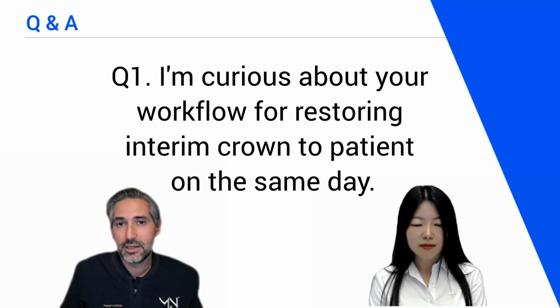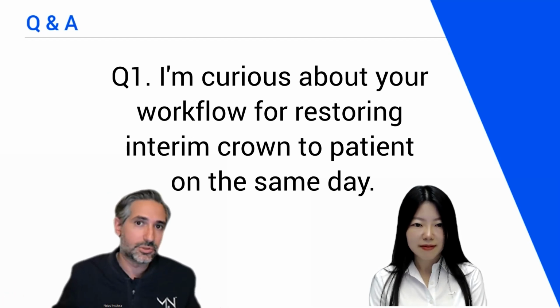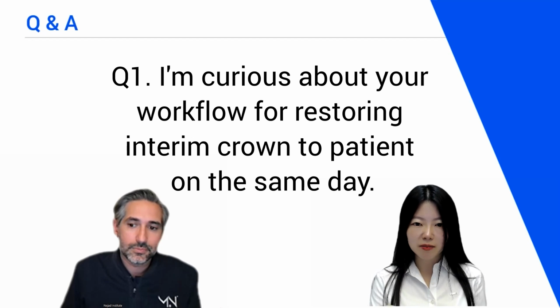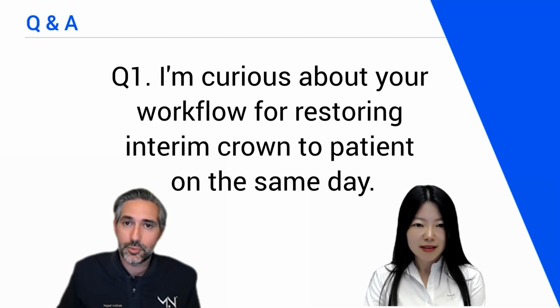You can also try doing the 3D printed shells before the appointment and reline them. That's also not a bad approach, but all in all, I don't find that necessary for 1 or 2 teeth, and I would reserve that for more like a quadrant of crowns or something like that. It means for single crown, just you use the powder and liquid resin. Well, powder and liquid was one way, and I did that for years.